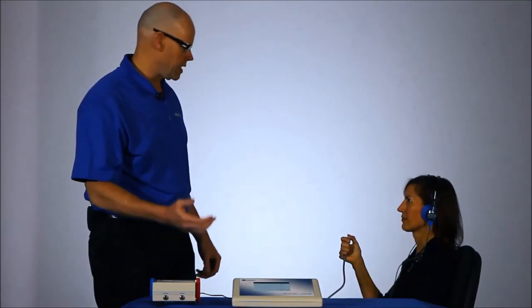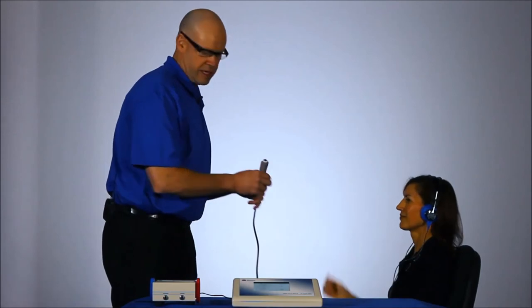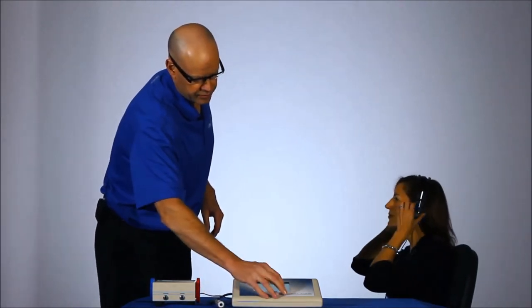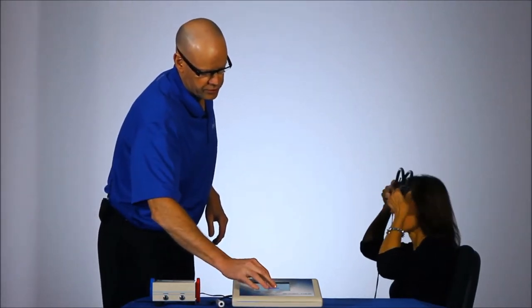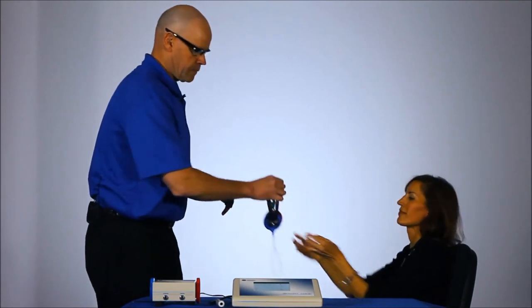At the conclusion of the test, when your test is over, we'll ask Delia to take that headset off and make sure we can review our results here. A typical test in automatic mode will take between four to five and a half minutes if a person has normal hearing.